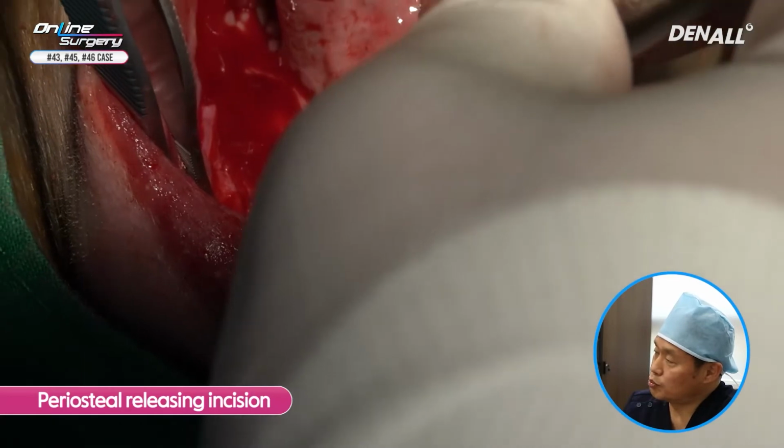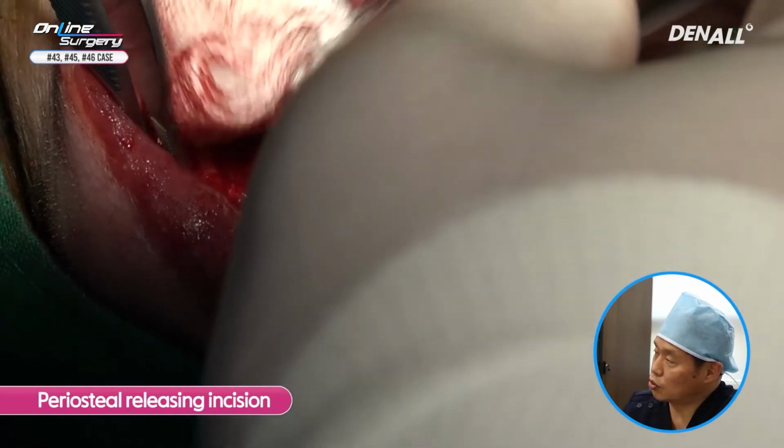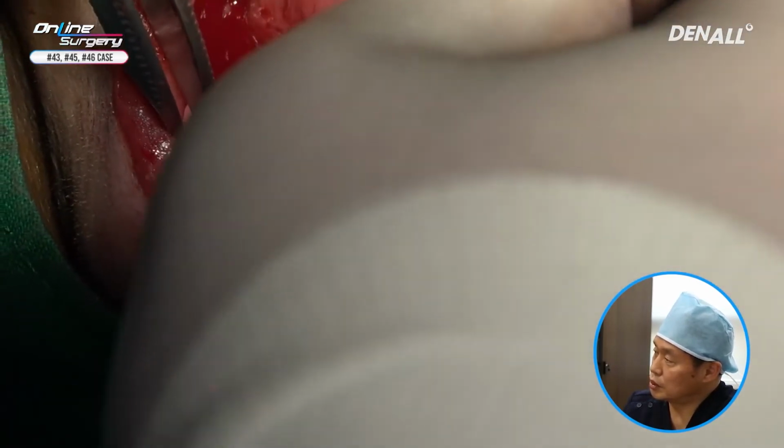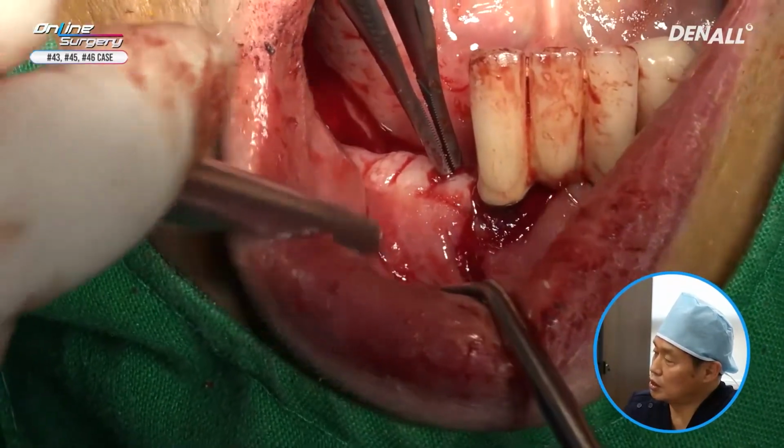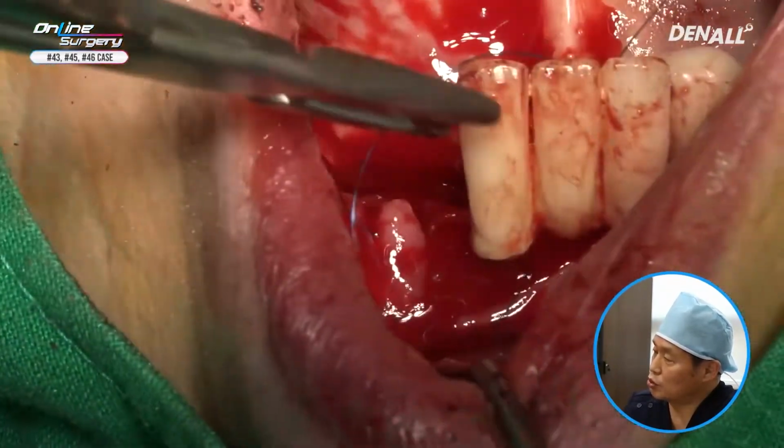Periosteal releasing incision is done. The area where augmentation was done with OssBuilder, a tension-free suture is going to be done. This is where the mental nerve is, so you need to pay extra attention.